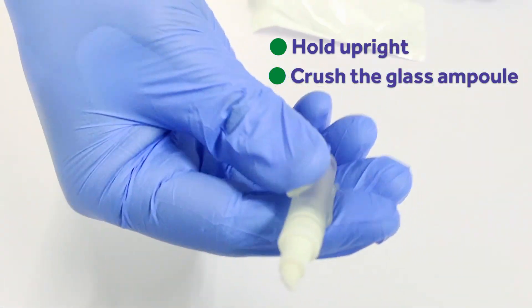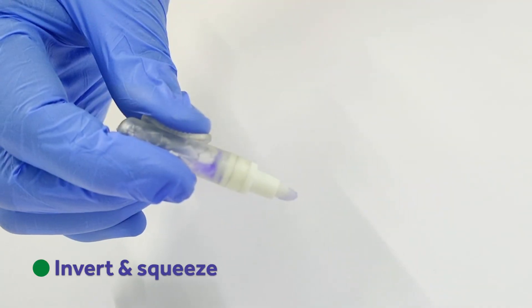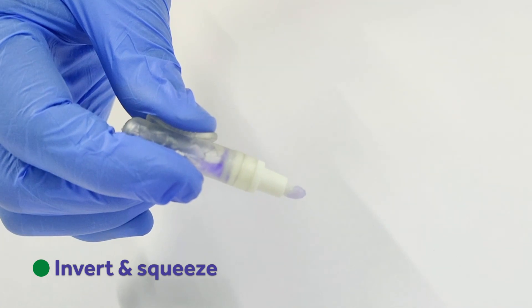Hold the applicator upright and crush the glass ampoule. Invert the applicator and squeeze the flexible tube.